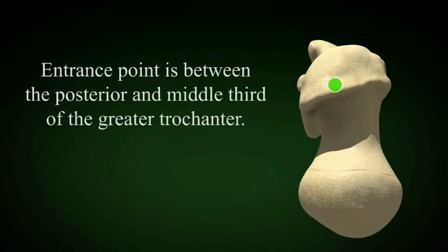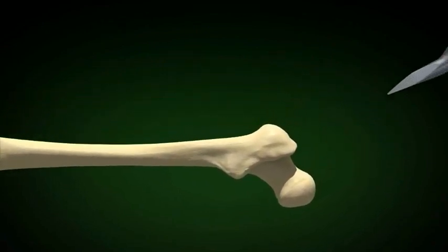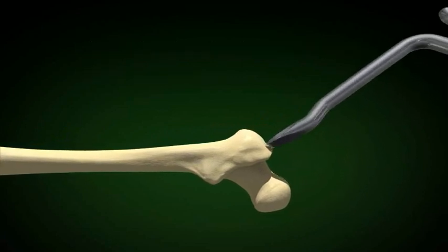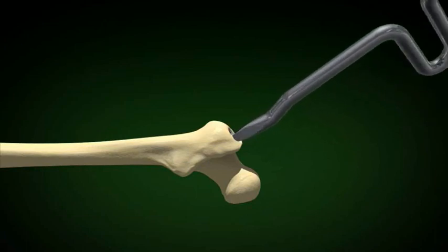The entrance point is between the posterior third and middle third of the greater trochanter. This femur does not have the usual anterior bow. The hole is made using a curved awl. Look at the curve of the awl to be sure you don't penetrate the cortex distally.